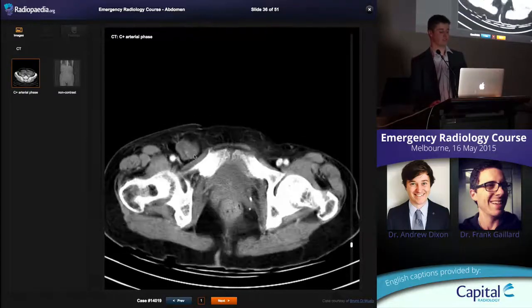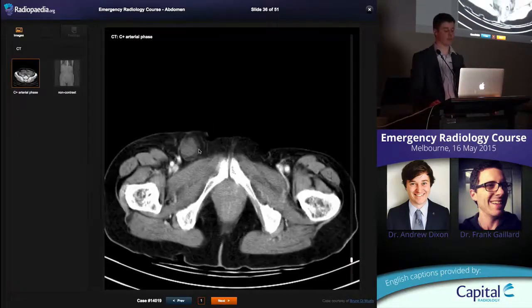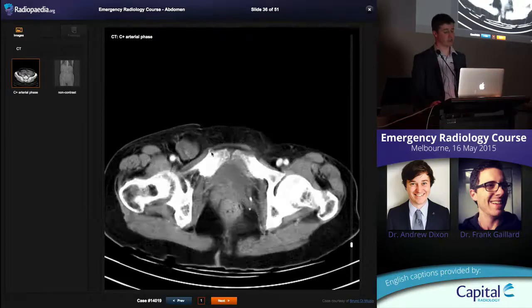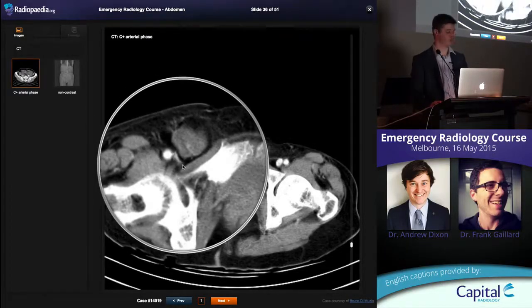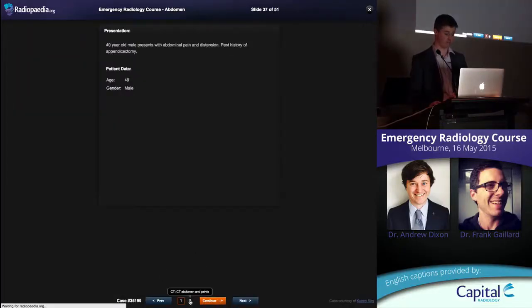So look for hernias. Differentiating between femoral and inguinal hernias. Femoral hernias tend to happen in women. It's located out lateral to that pubic tubercle, whereas an inguinal hernia will continue and come towards that. And a femoral hernia almost always compresses the femoral vein. Look at that. See that vein squashed? Artery here, vein completely squashed by it. So that's in the femoral canal. An inguinal hernia won't tend to squash your femoral vein, okay?